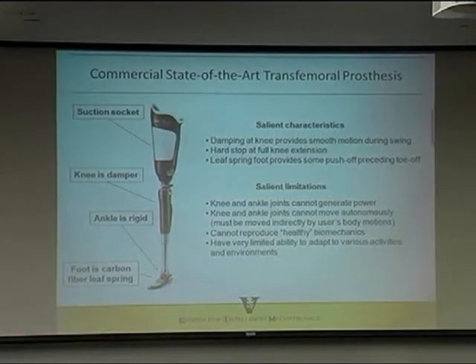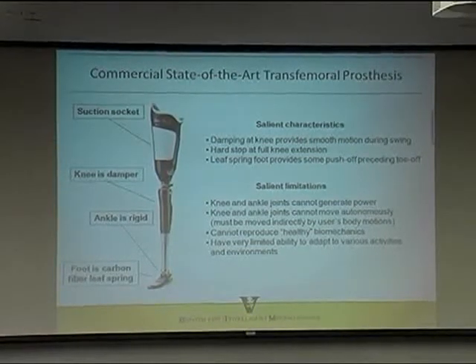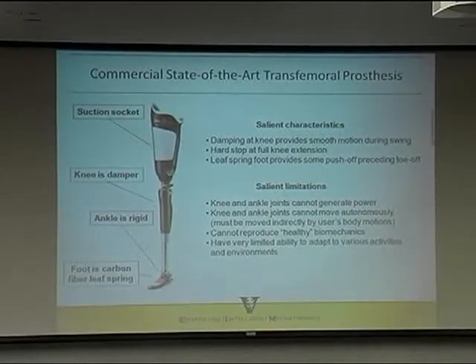Upper extremity prosthesis and lower extremity prostheses. I'm going to start with lower extremity, probably spend about two-thirds of my talk on talking about legs, and then maybe the last third talking about arms. So let's start with the state of the art for legs.